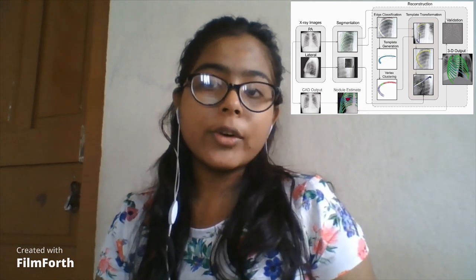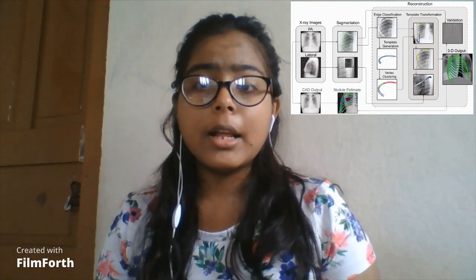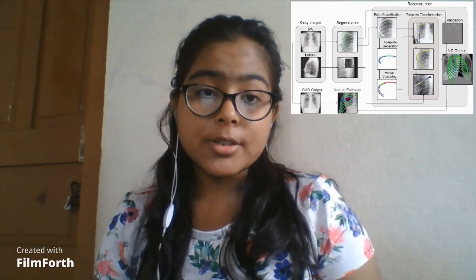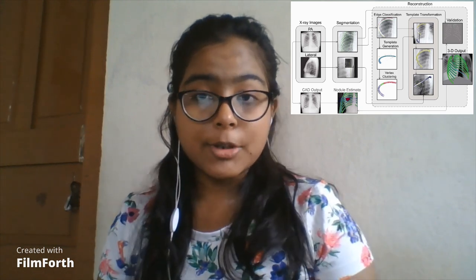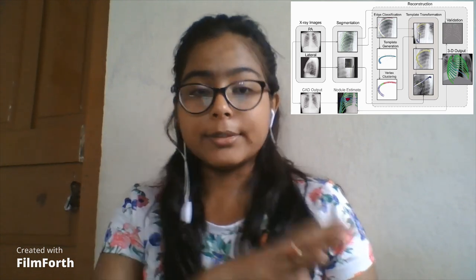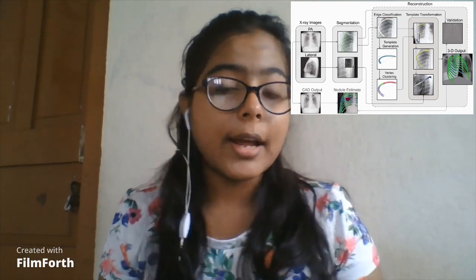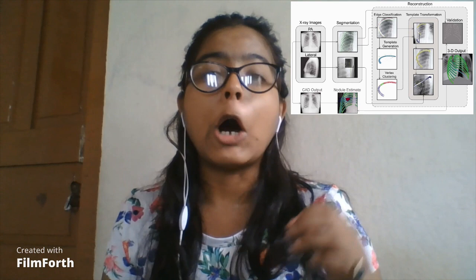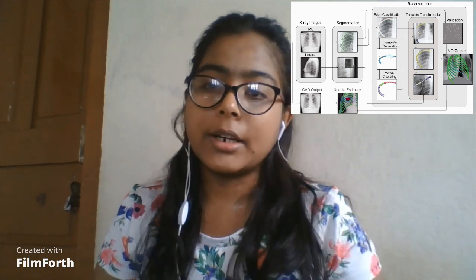There is currently no reliable way to automatically segment the individual ribs or even the outer border of the rib cage in lateral X-ray images, due to the fact that there is a lot of noise in lateral X-ray images, and the ribs of both sides of the body are superimposed on each other. For this reason, an interactive approach was used to identify the outer border of the rib cage in the lateral X-ray images.